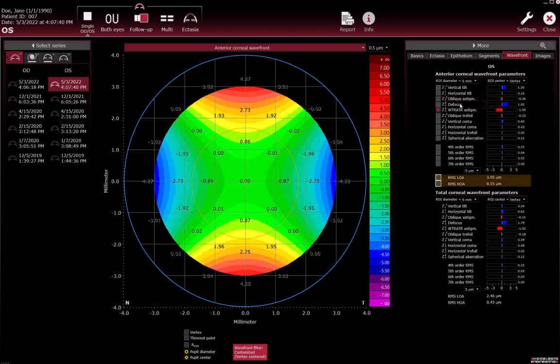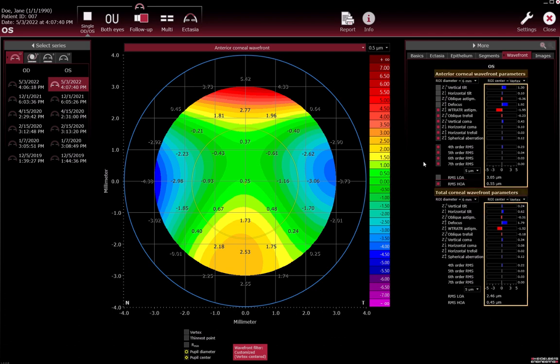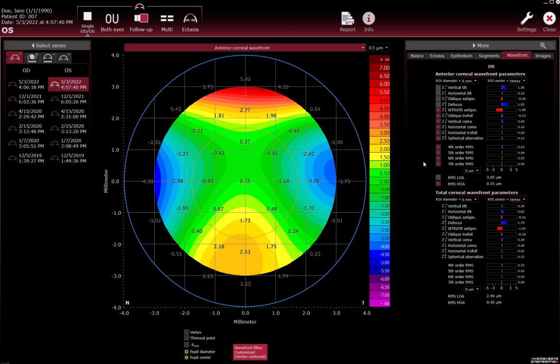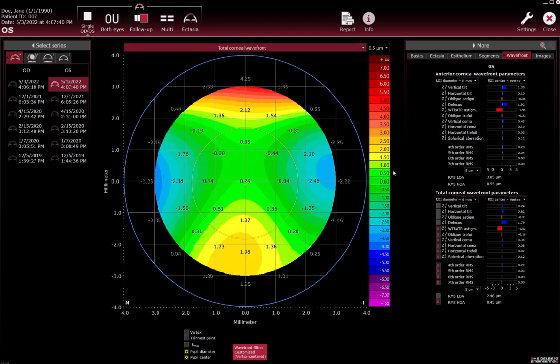Lower order aberrations (LOA) or higher order aberrations (HOA) can be selected. Find the RMS values in the Wavefront tab. Compare values of anterior corneal wavefront and total corneal wavefront. Select the map in the drop-down list. Previously selected parameters are carried over.